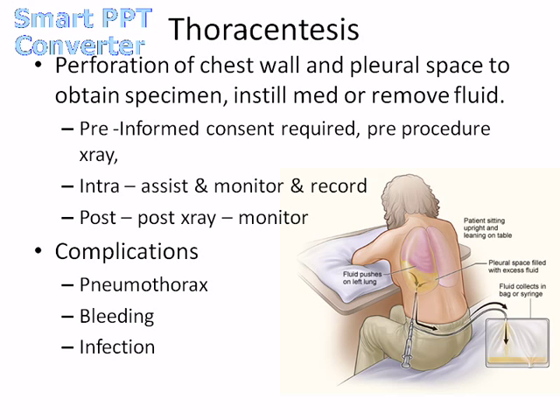A thoracentesis is a surgical perforation of the chest wall and the pleural space with a large bore needle. It is performed to obtain specimens for diagnosis, or to instill a medication into that pleural space, or to remove fluid from an effusion, or it could be to remove air from the pleural space just to relieve the pleural pressure. It's performed under a local anesthetic.